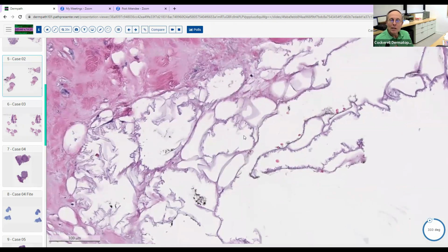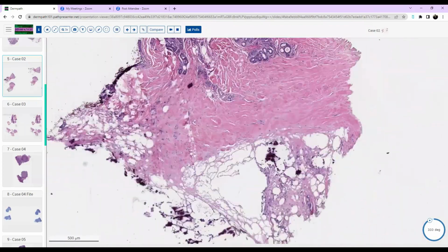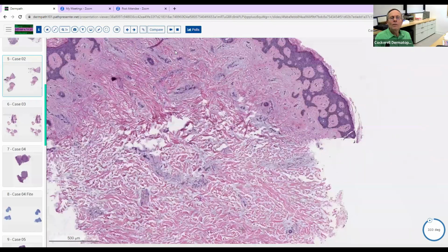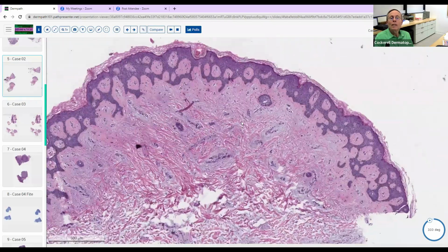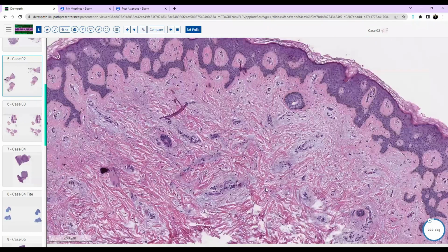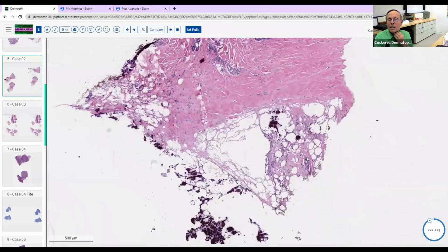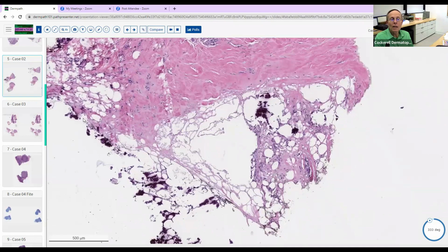It basically just means that that fat has gradually died because it's not getting enough oxygen. So it can be seen in other settings also. It doesn't necessarily mean it's lipodermatosclerosis, but it means that there's obviously something going on and causing that. So if you look here, we don't really see very much in the way of stasis type change, do we, up here? No. Got a little bit of mucin. But we've got mainly just this deep sclerotic collagen and this lobular panniculitis and dystrophic calcification.